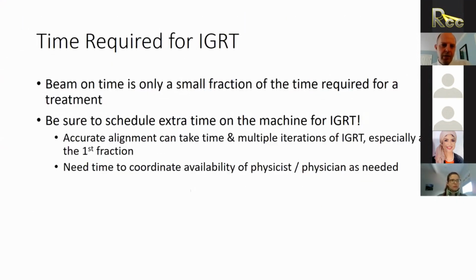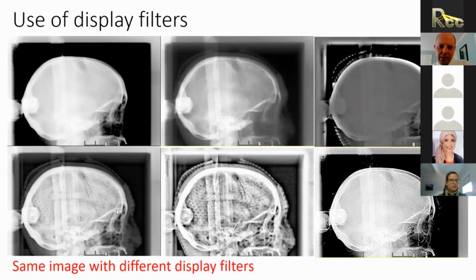And just another note about the time required. So we got a question here. What's the name of the filters? There are names for these. I don't remember exactly what they are. Yeah, I would say it may differ between vendors. So I would just look in the system and play around with it and see what exactly you have as options.